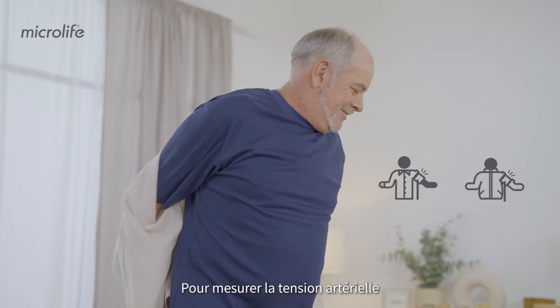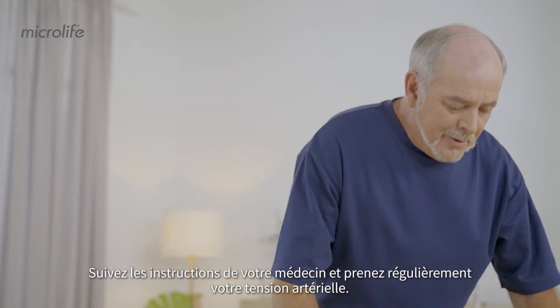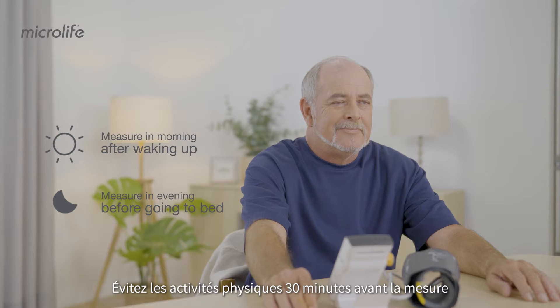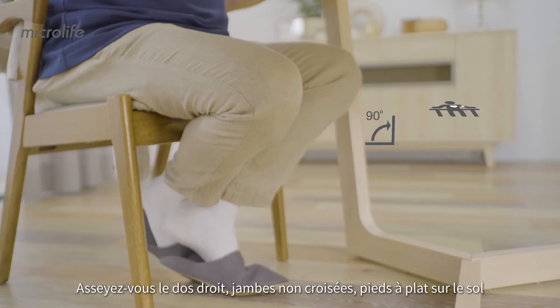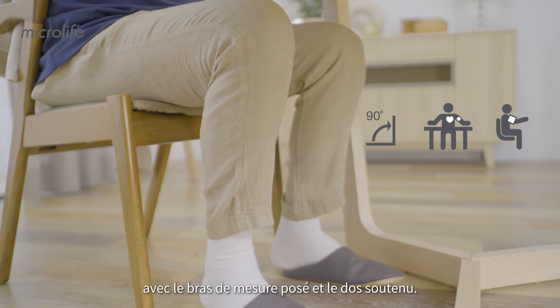To measure blood pressure, start by removing any thick clothing. Follow your doctor's suggestions and measure regularly. Avoid activities 30 minutes prior to the measurement. Empty your bladder and rest briefly. Sit up straight, legs uncrossed, feet flat on the floor, with your measuring arm and back fully supported.